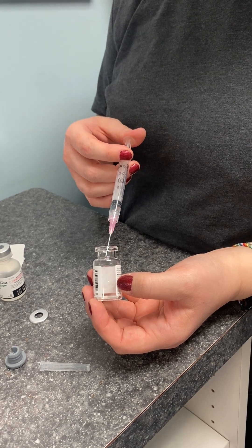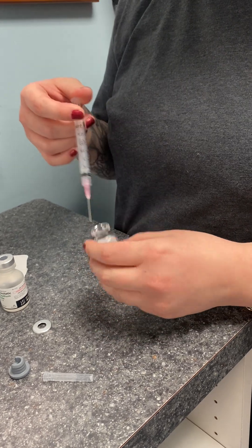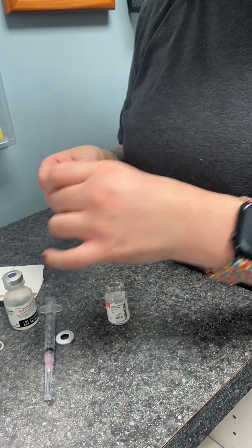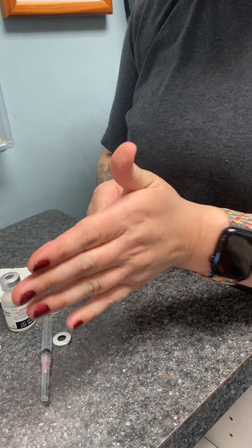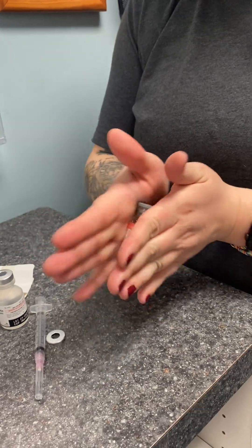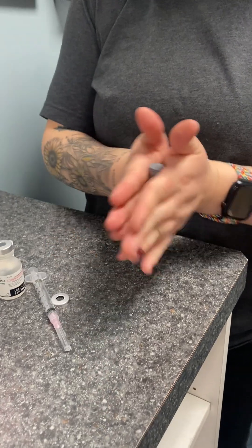She'll put the stopper back on and just roll it between her hands to mix it. That is now mixed and ready to use.